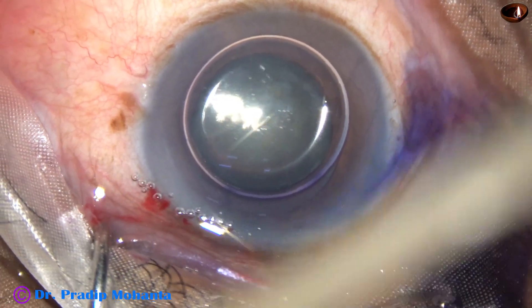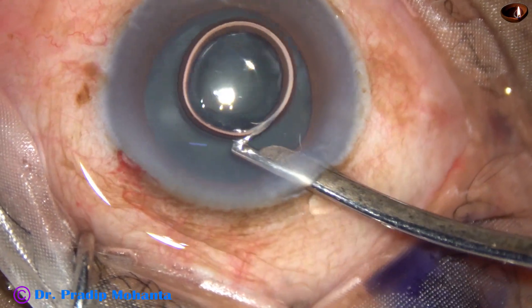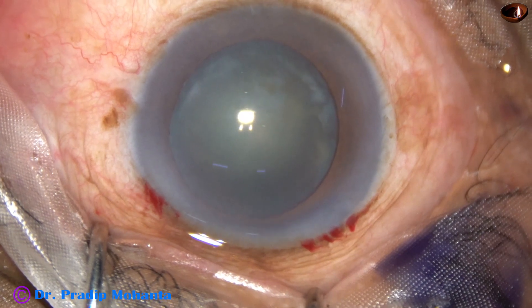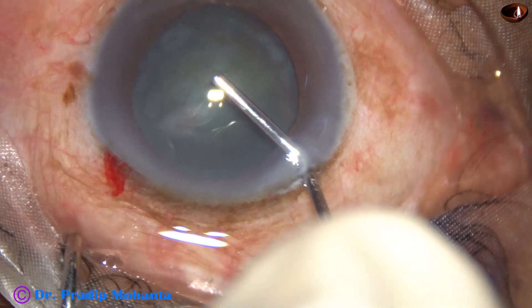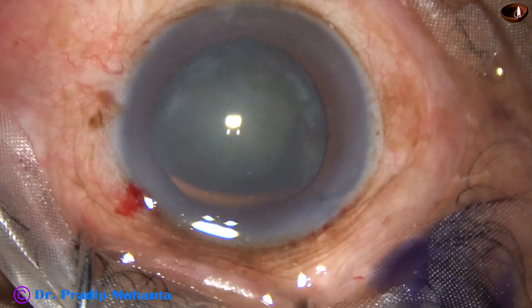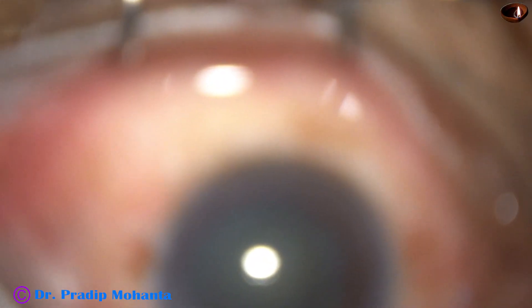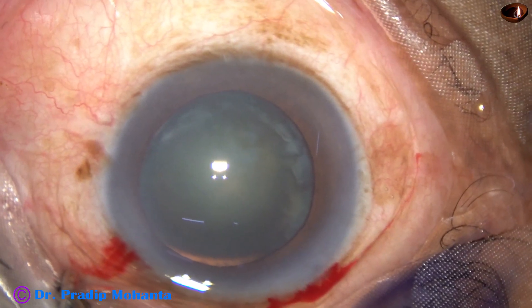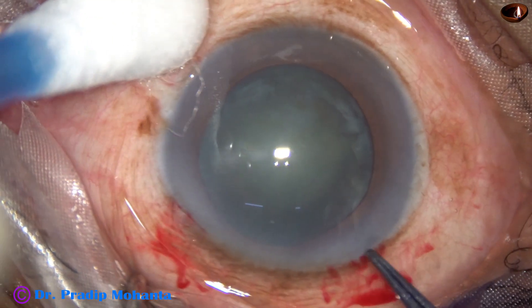This is a bit of adrenaline and now the dye is washed out. If we do not wash out and instead replace the dye with visco, there will be higher concentration of visco at some places and lower concentration in others, which will cause visibility issues. So it is better to wash out the dye and then inject visco.